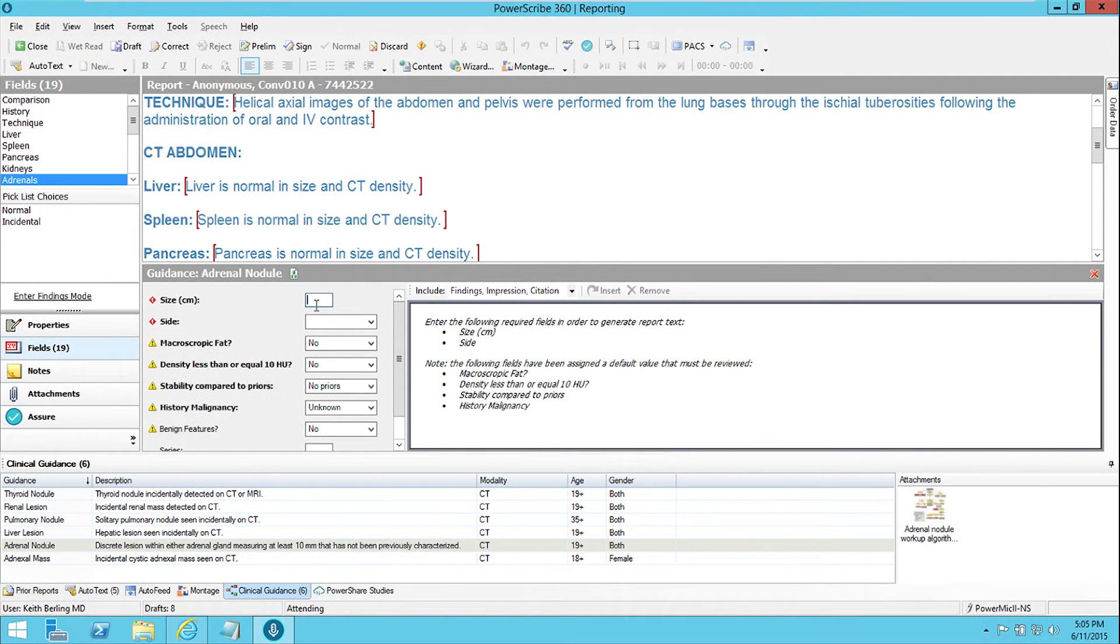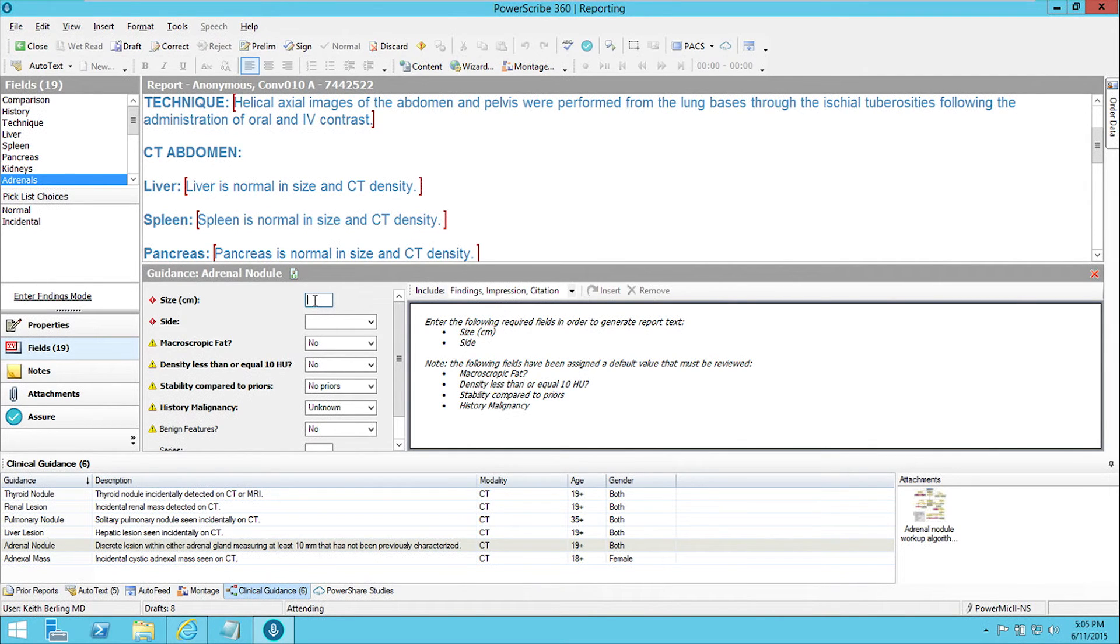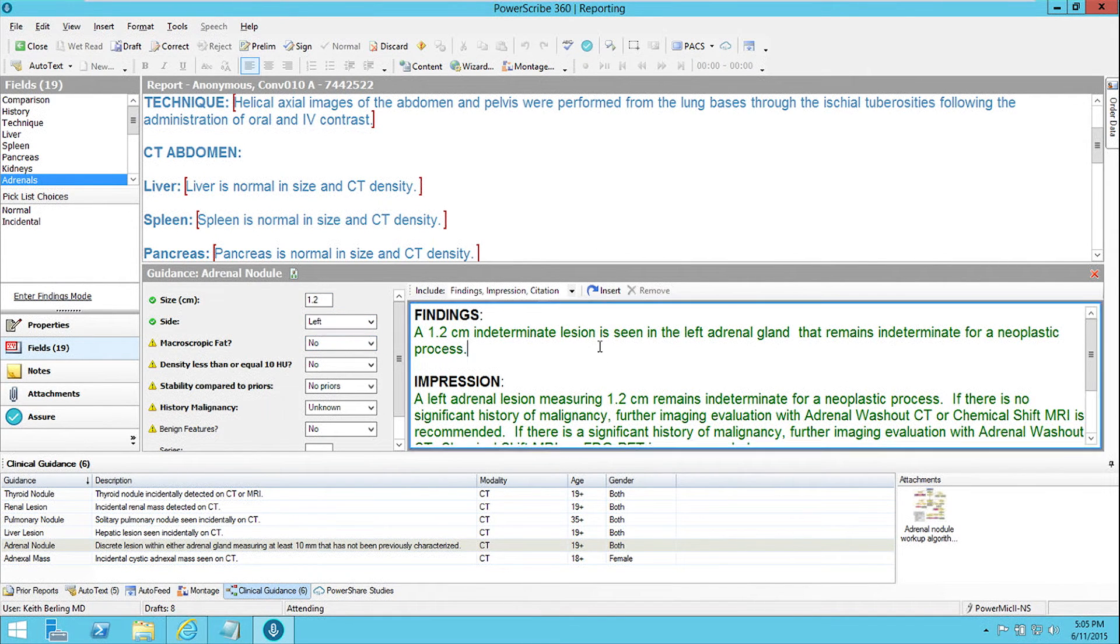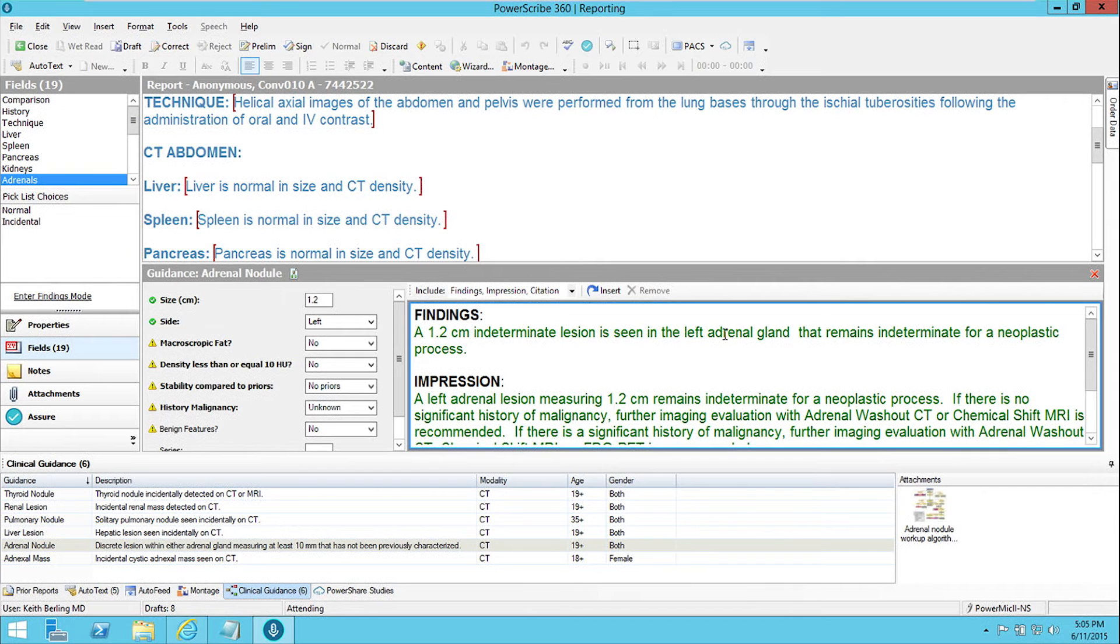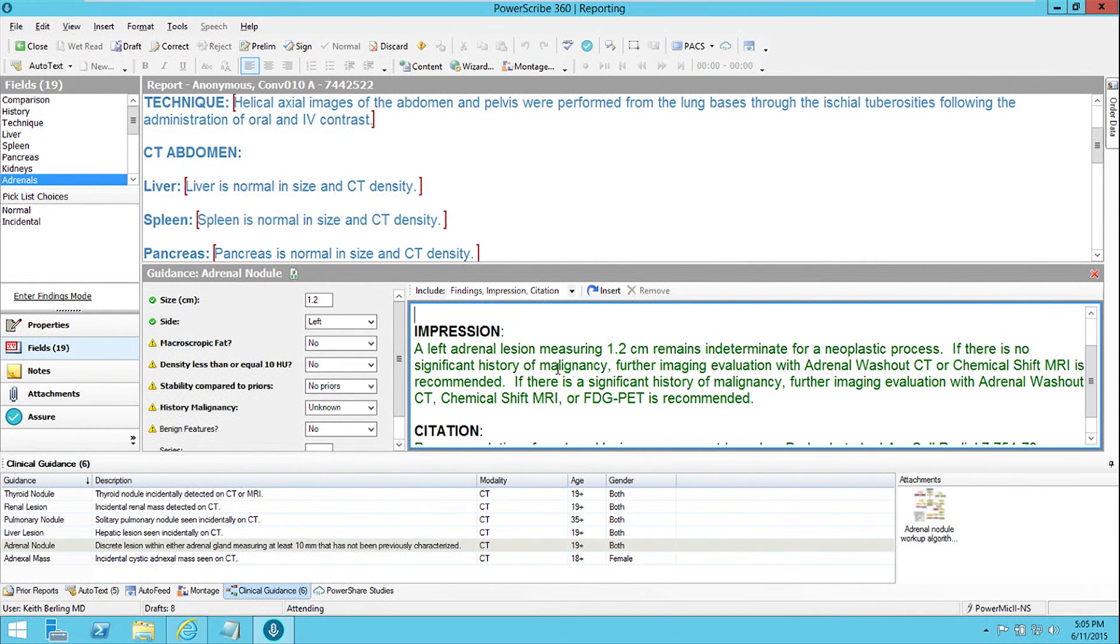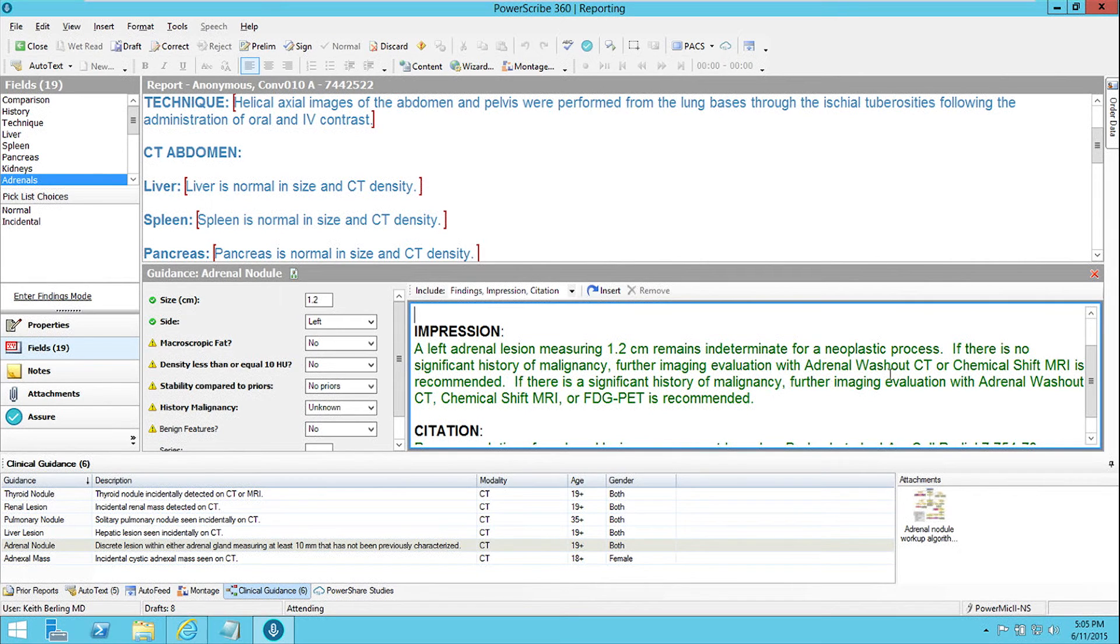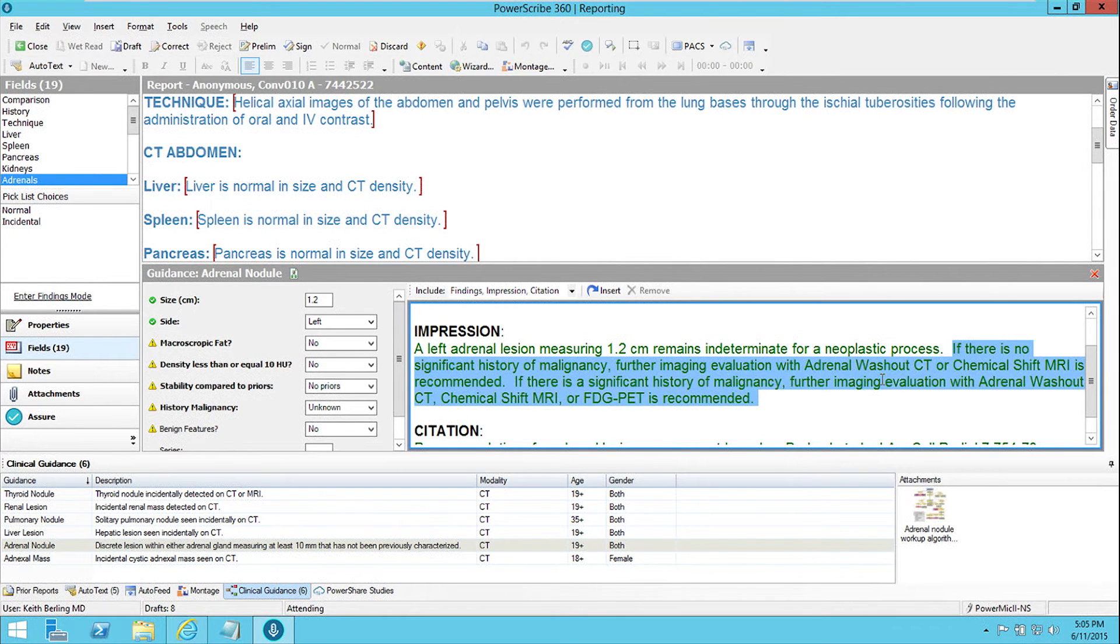and then click on adrenal nodule within the clinical guidance tab, and start to describe this adrenal nodule using the fields that the tool supplies to me. So I can say that it is 1.2 centimeters in size, it's on the left side, and right away it generates appropriate report text for me. So it says a 1.2 centimeter indeterminate lesion in the left adrenal gland remains indeterminate, and then generates appropriate impression text, and most importantly specifies exactly what the recommendation is.